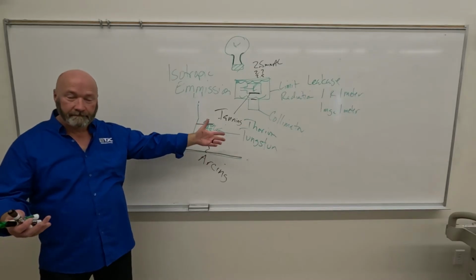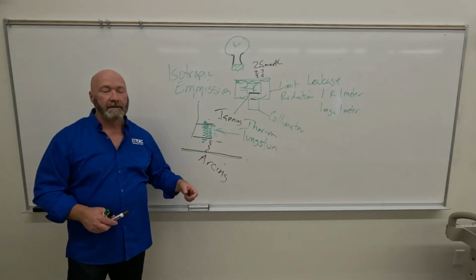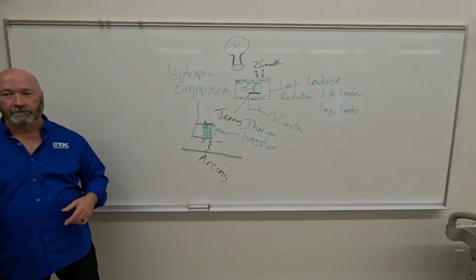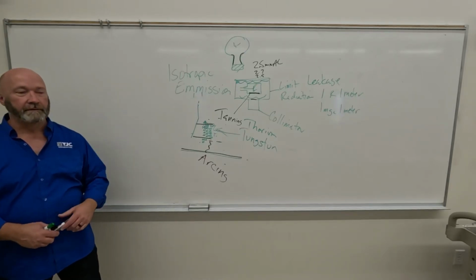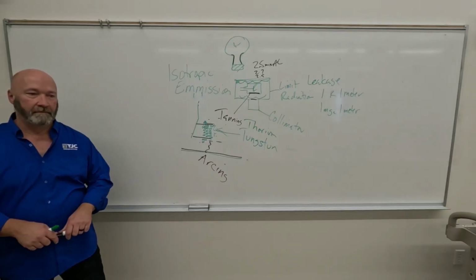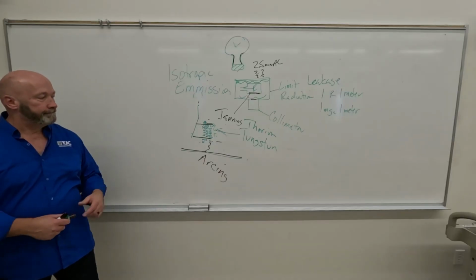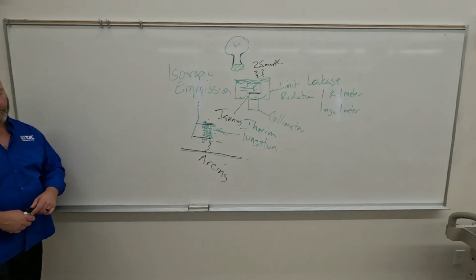So again, main cause, heat, right. Arcing though is going to be your most common cause of instantaneous tube failure, tube death. You're shooting just fine, then you're pow, you got nothing. You got a short circuit, your x-ray tube is dead. So did arcing explode the casing? No, it's not likely. I suppose it could, but probably not. But yeah, it's done at that point.